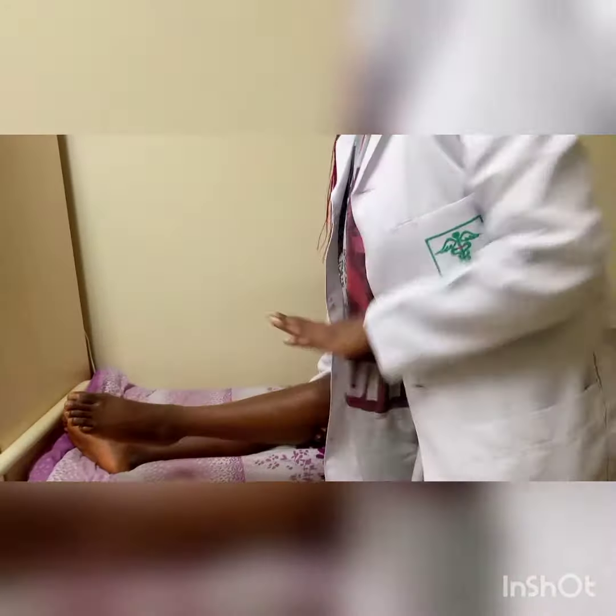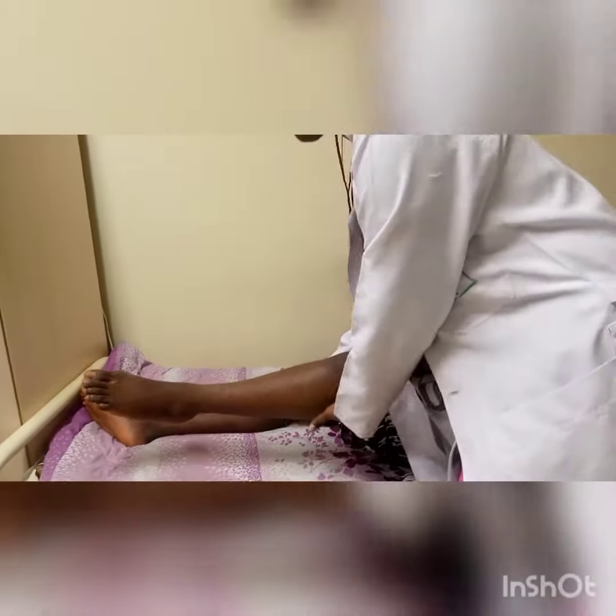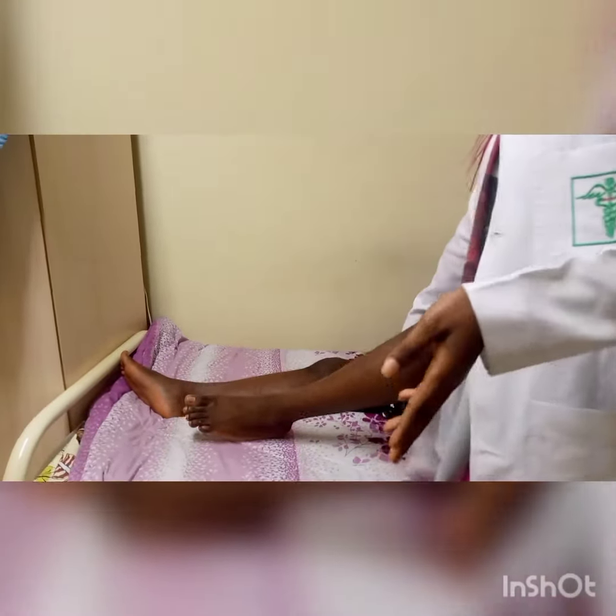The duration of use is about two weeks after surgery. When using a CPM machine after the patient has undergone surgery, you press the leg into the CPM machine at the area where it bends, pressing the limb to keep it in place. We don't have a CPM machine here, but here is what one looks like.